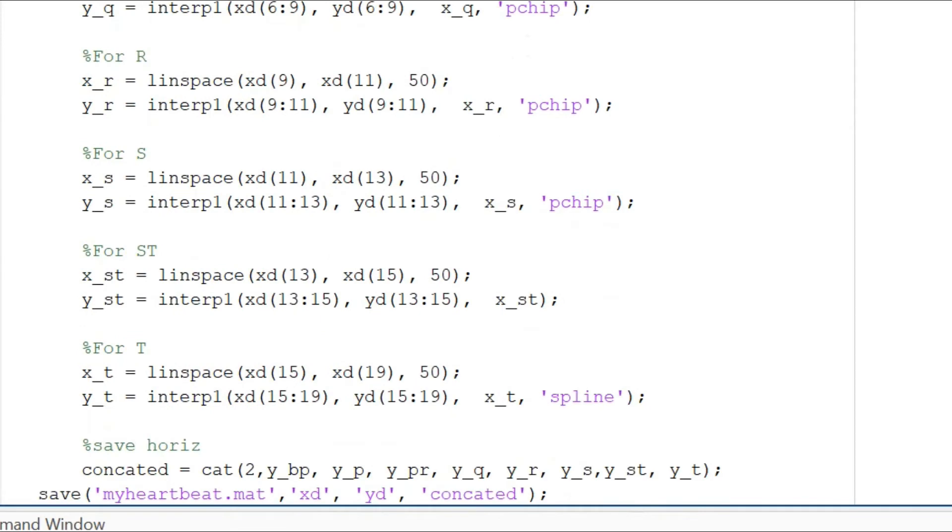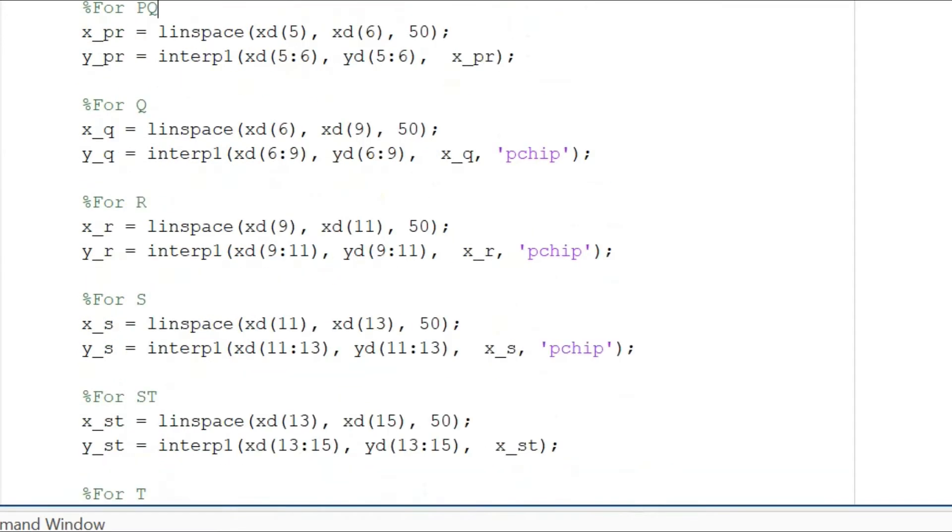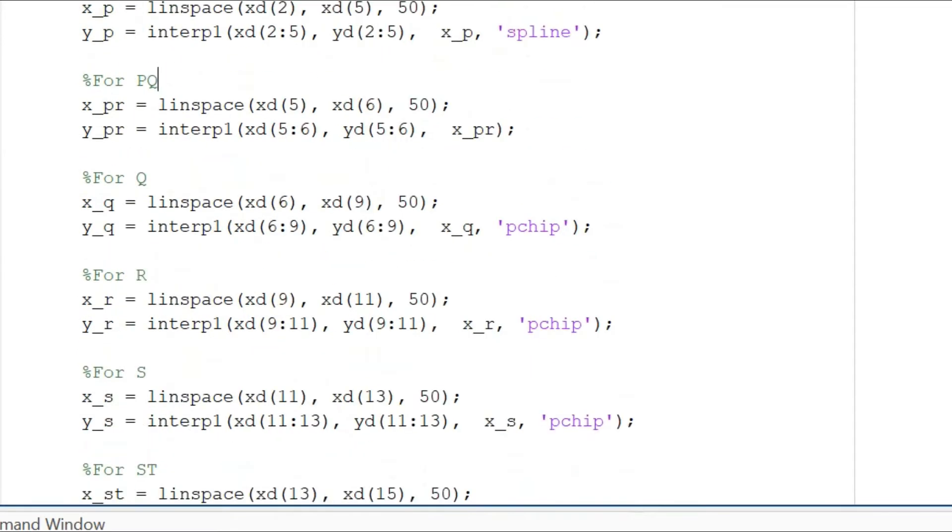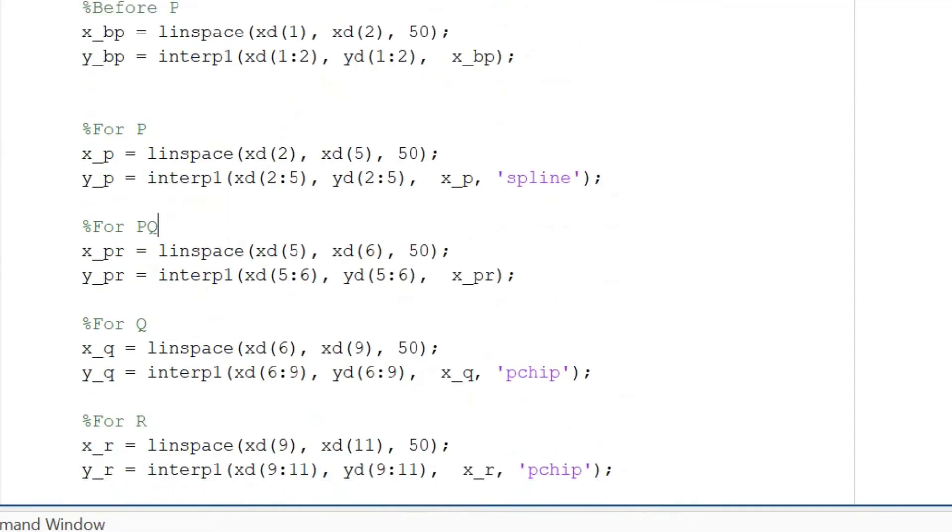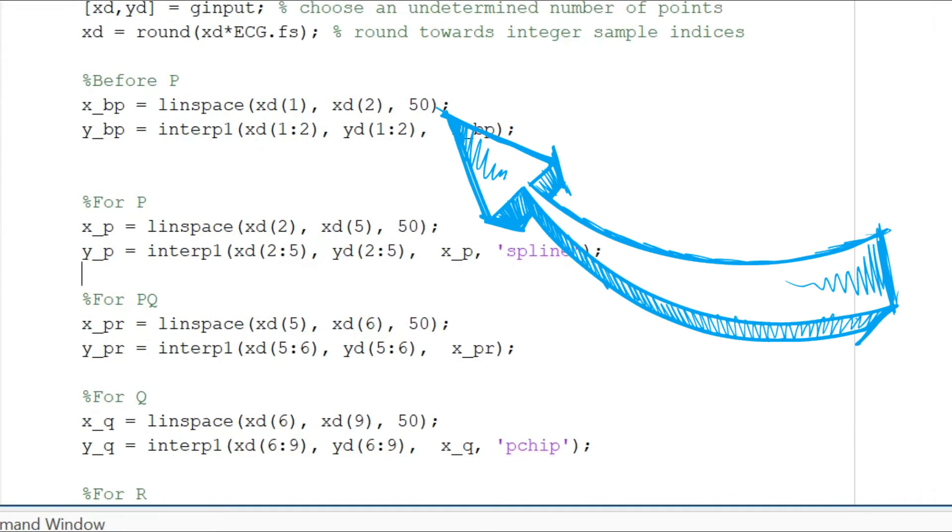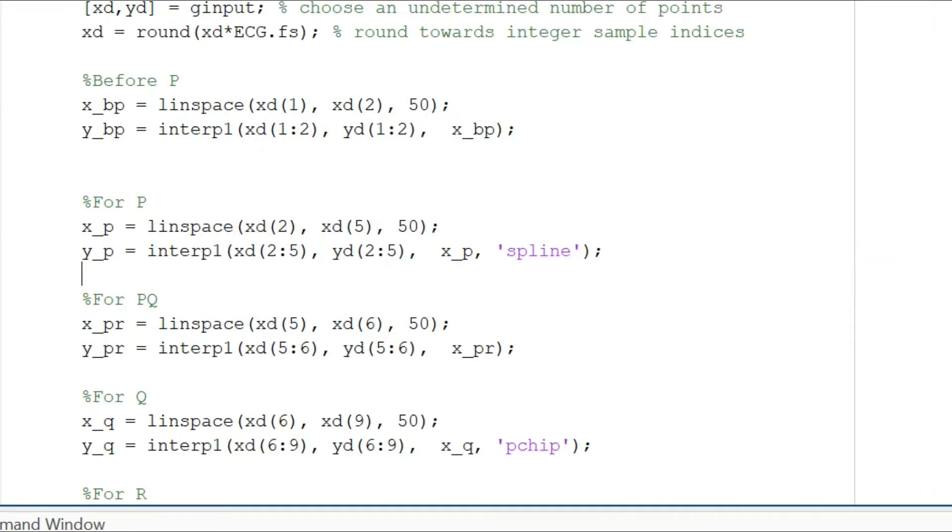This rounding off function is just so that we can get integer number of samples. The rest of the function is pretty straightforward. I will just explain what I have written over here. With this particular statement I indicate that I need 50 points between the XD first value and the XD second value.